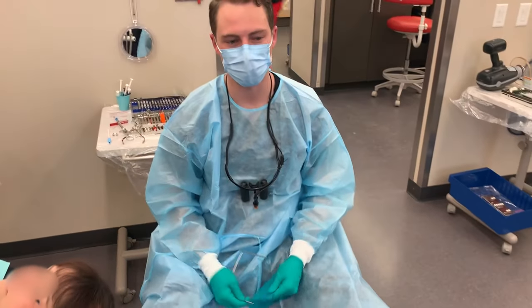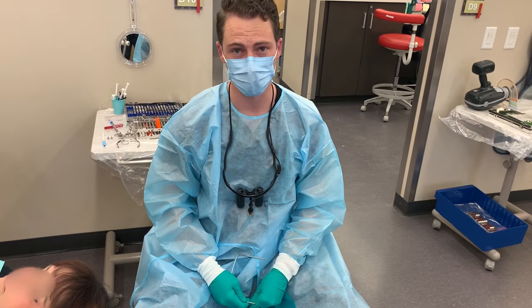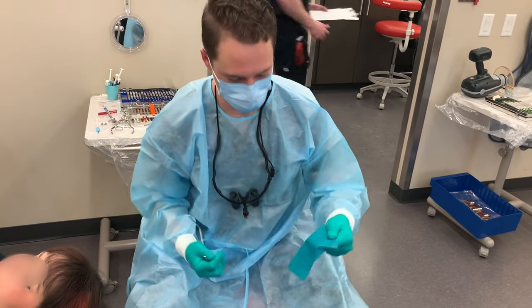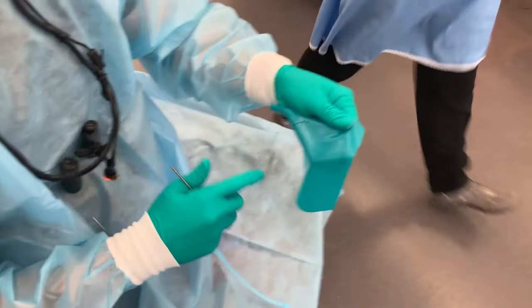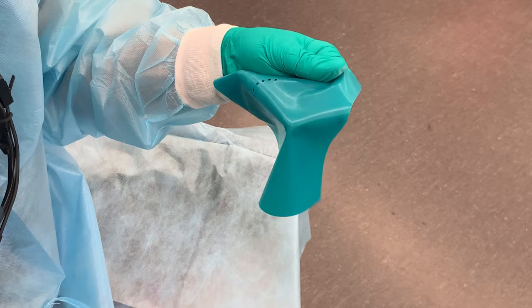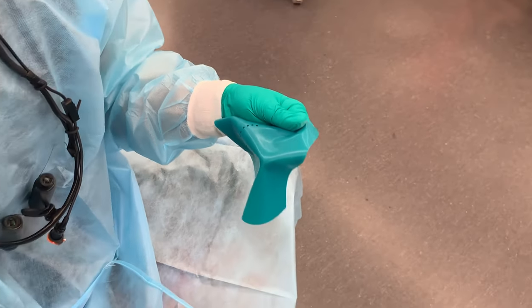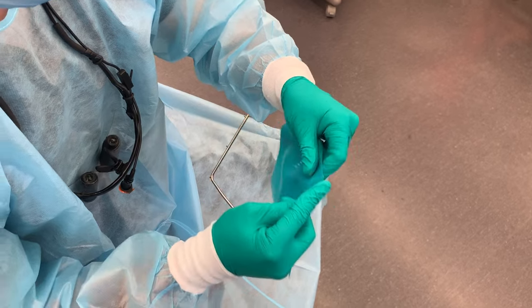Today we're going to show you how I like to place the rubber dam. I feel like I can normally get it on pretty darn quick. So first things first, punch your holes. I like to do the biggest holes possible — it makes putting it on so much easier and you still get a tight connection to the tooth.